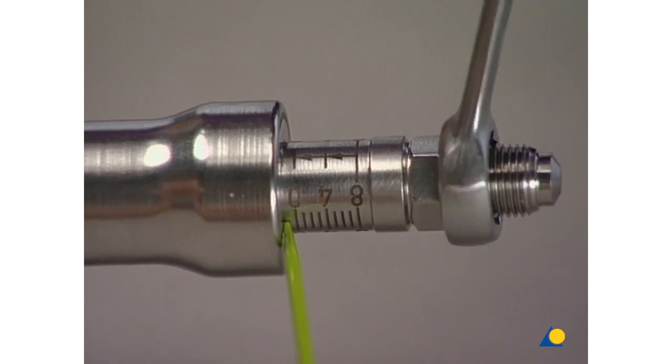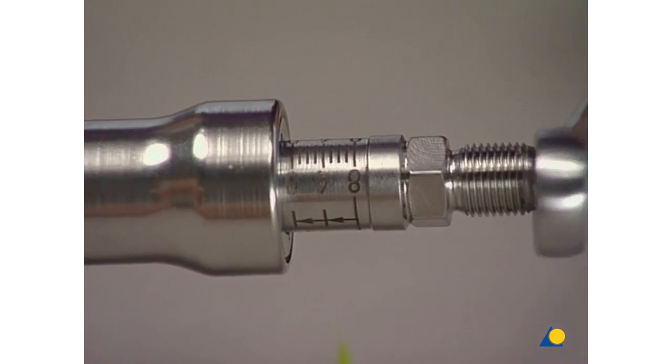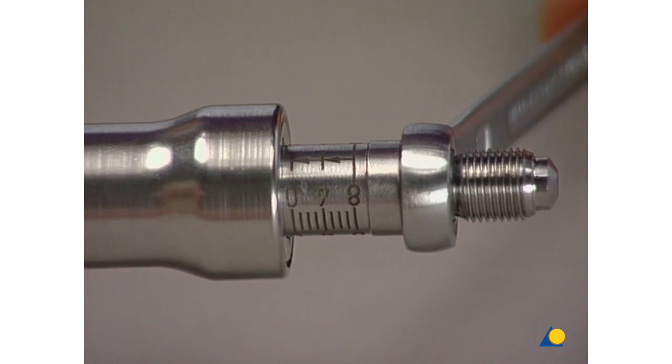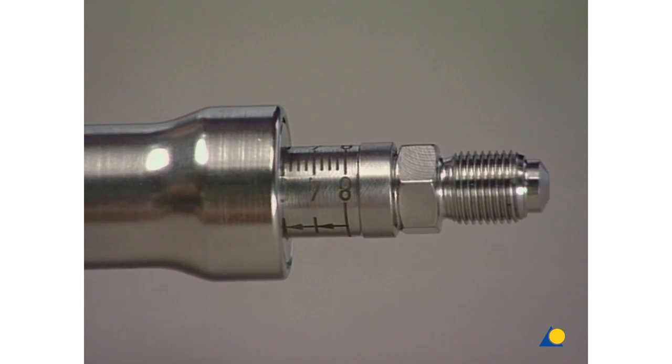Before inserting the nail, tighten the screw with the combination wrench up to the 0 millimeter mark. The maximal compression length is 8 millimeters.